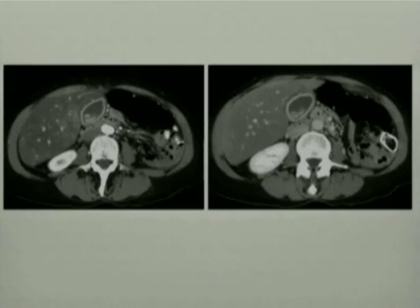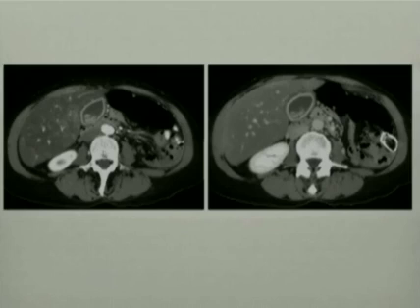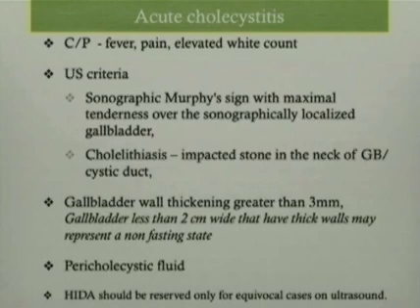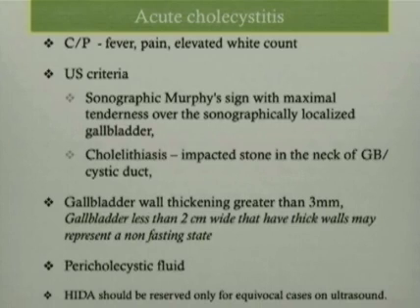In today's world, CT scan plays an important role in any patient who walks into the ED with abdominal pain, and most of these cases who do not have a primary diagnosis of gallbladder disease may get a CT scan first before an ultrasound. These two CT pictures demonstrate a very classical picture of acute cholecystitis — you see a very enhancing thickened gallbladder wall, some gallstones, pericholecystic fluid, and gallbladder wall edema. Patients usually present with fever, pain, and elevated white count.